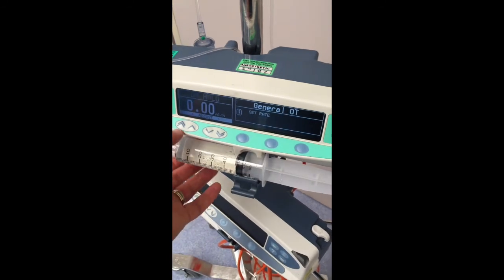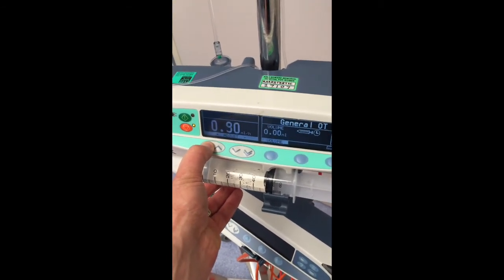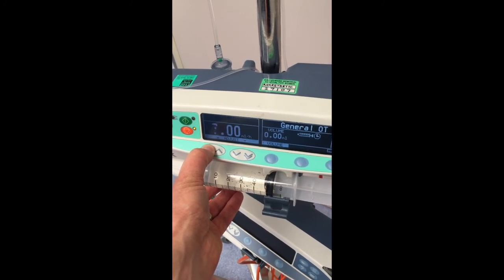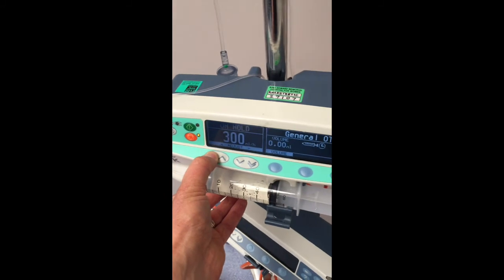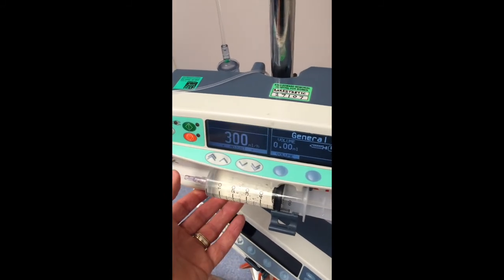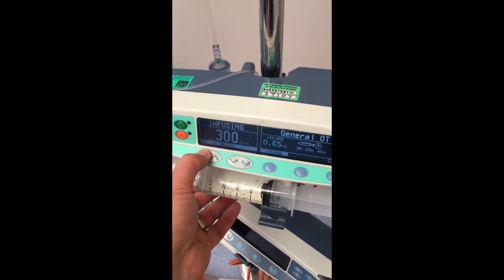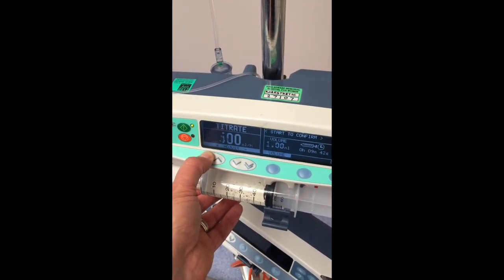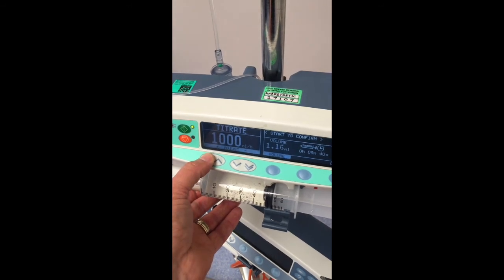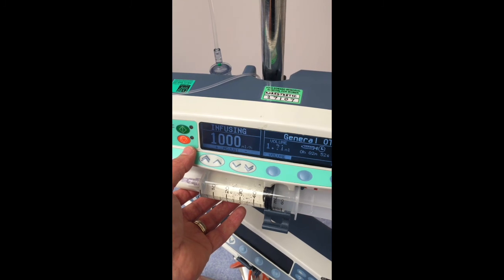In elective situations such as correcting congenital fibrinogen deficiency prior to elective surgery, administer each gram of fibrinogen over 10 minutes. This corresponds to 300ml per hour on a syringe driver. In emergency situations such as a patient experiencing critical bleeding, administer each gram over 3 minutes. This corresponds to 1000ml per hour on a syringe driver.